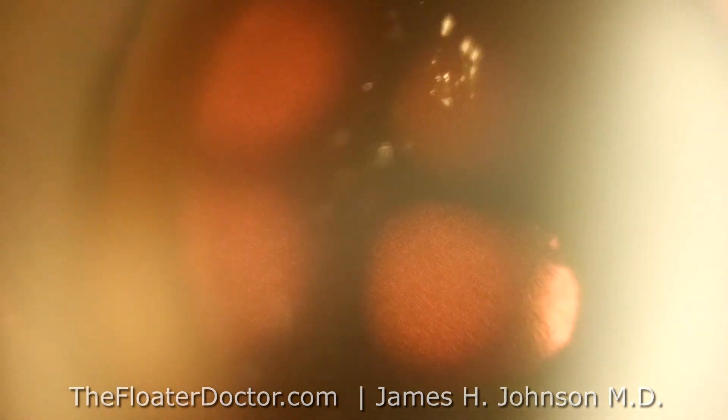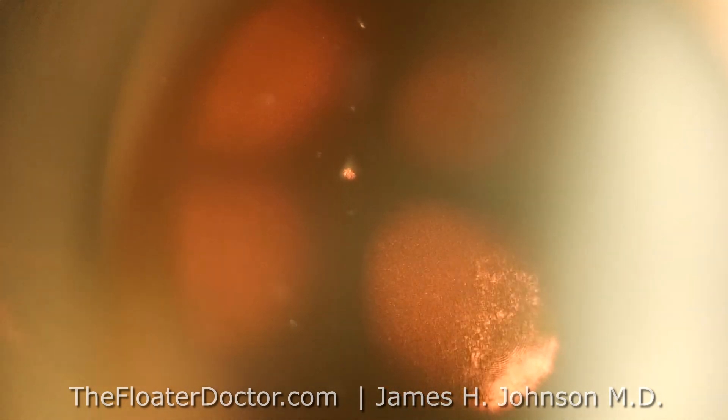I think probably two treatments for you — this is going to be the main one, the bulk of it. Maybe just a little cleanup should take care of most of the rest. The nice thing about these types of floaters is they don't come back. This is not part of a progressive degenerative process — it pre-existed, peeled away from the back of the eye, and moved to where it became symptomatic. If I can definitively get rid of this, it's done — shouldn't come back, shouldn't need more treatment.